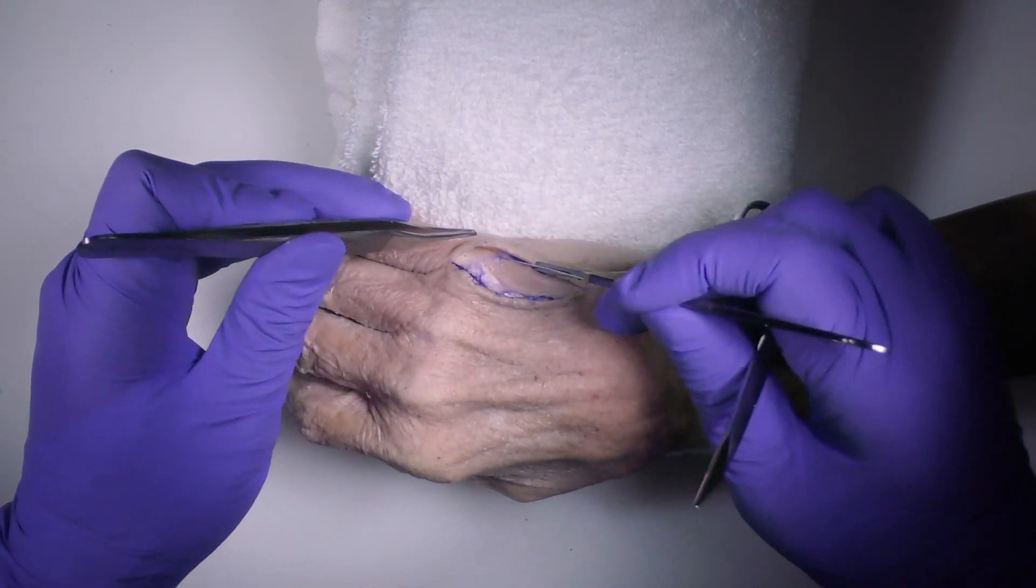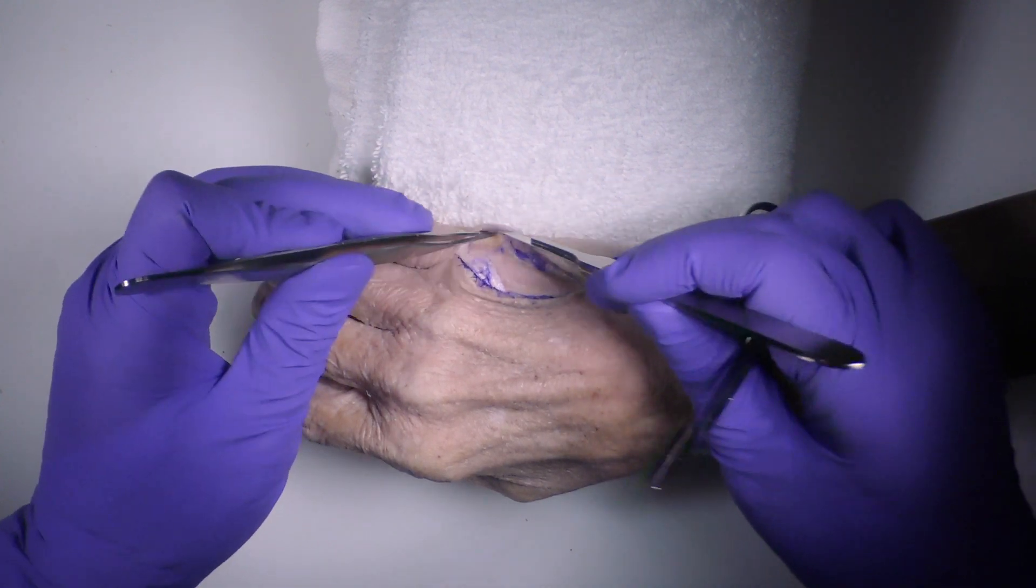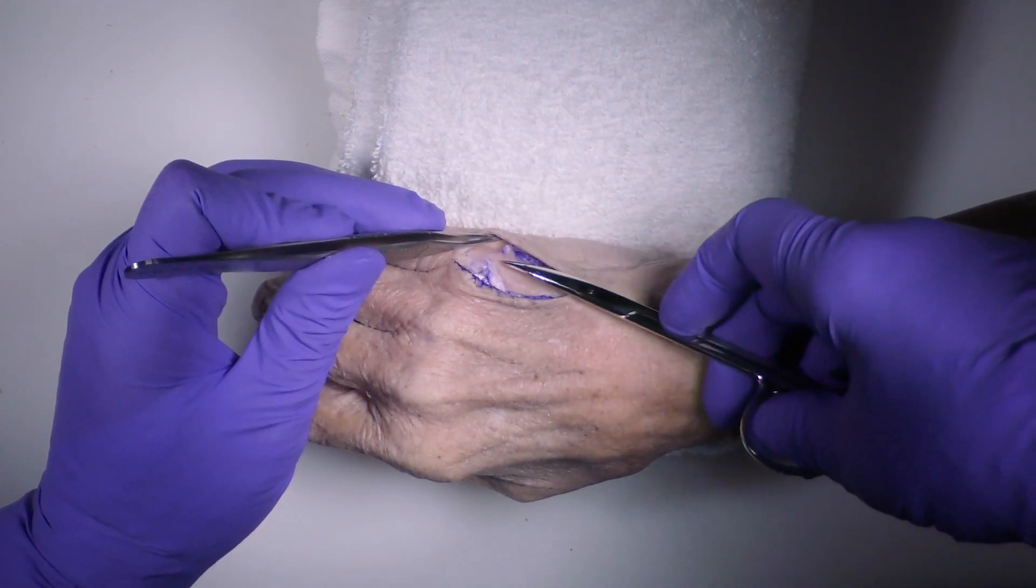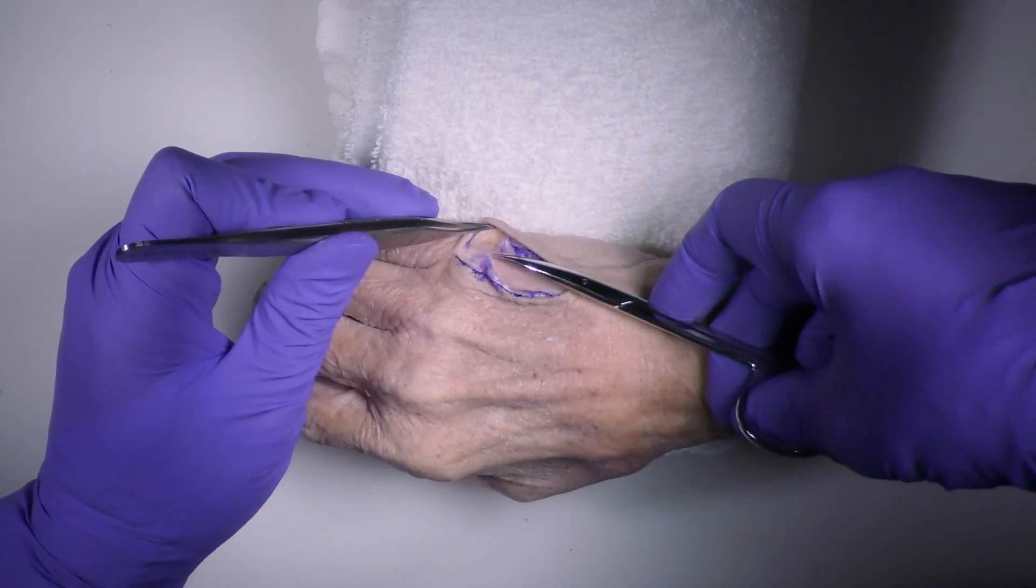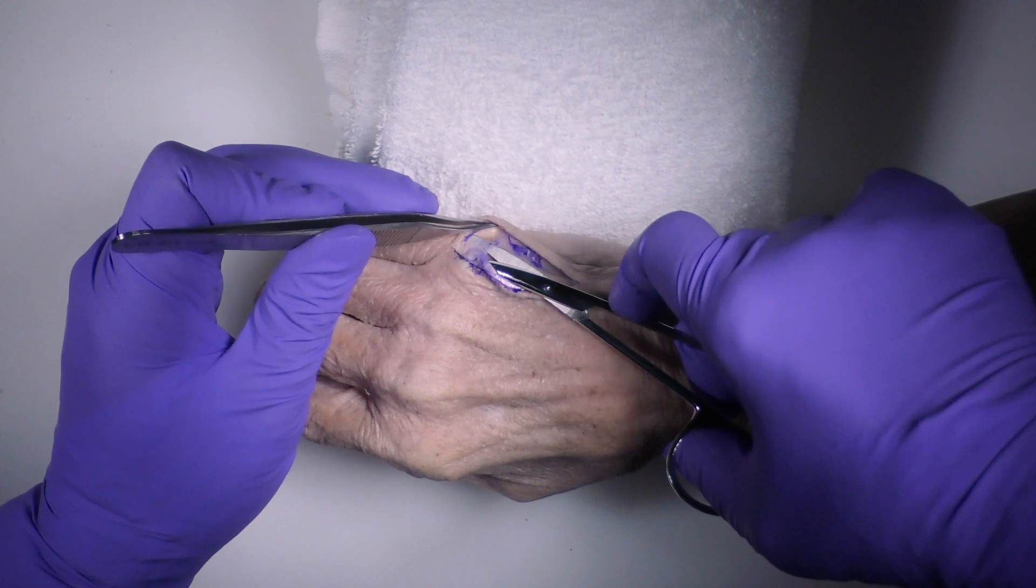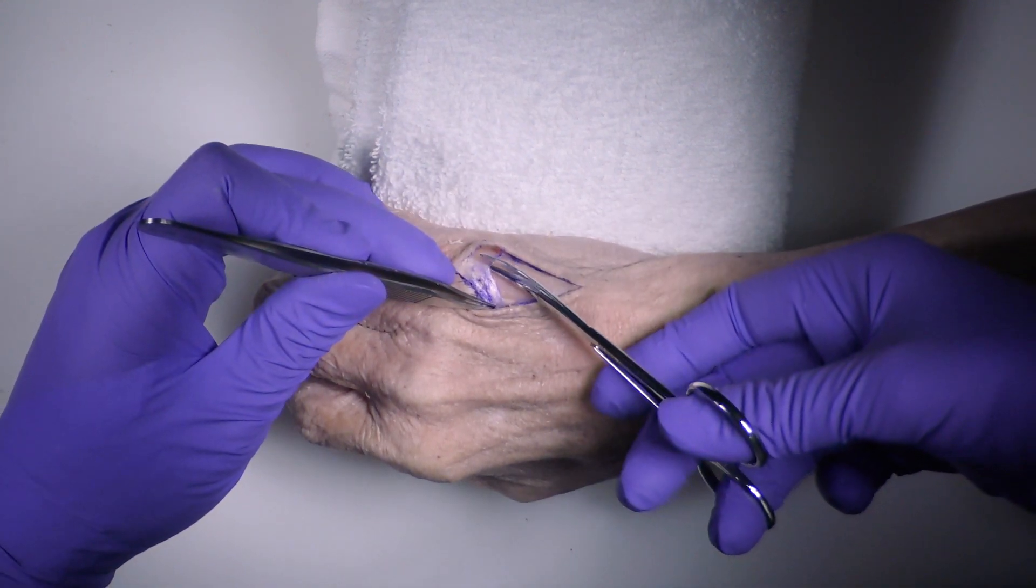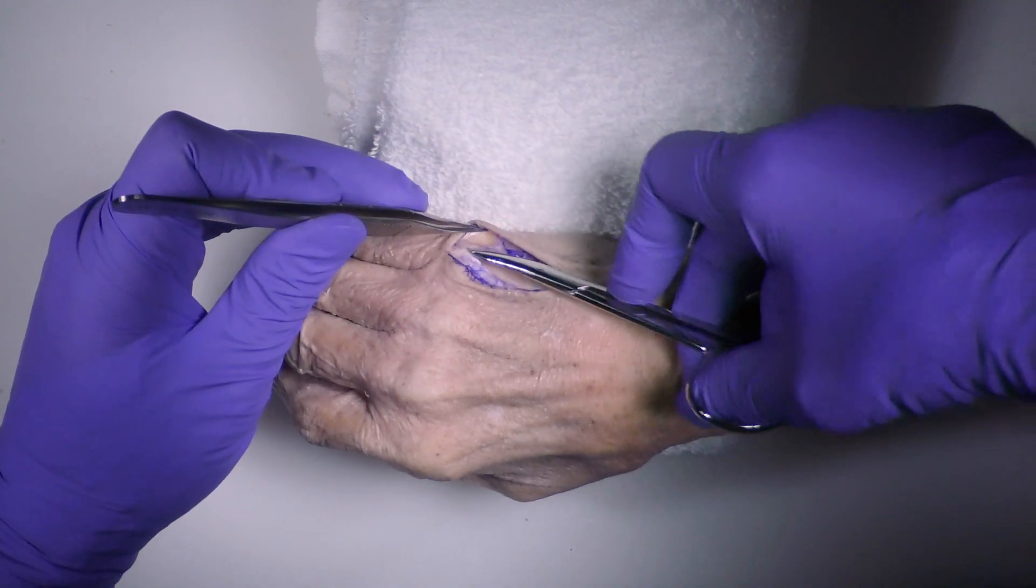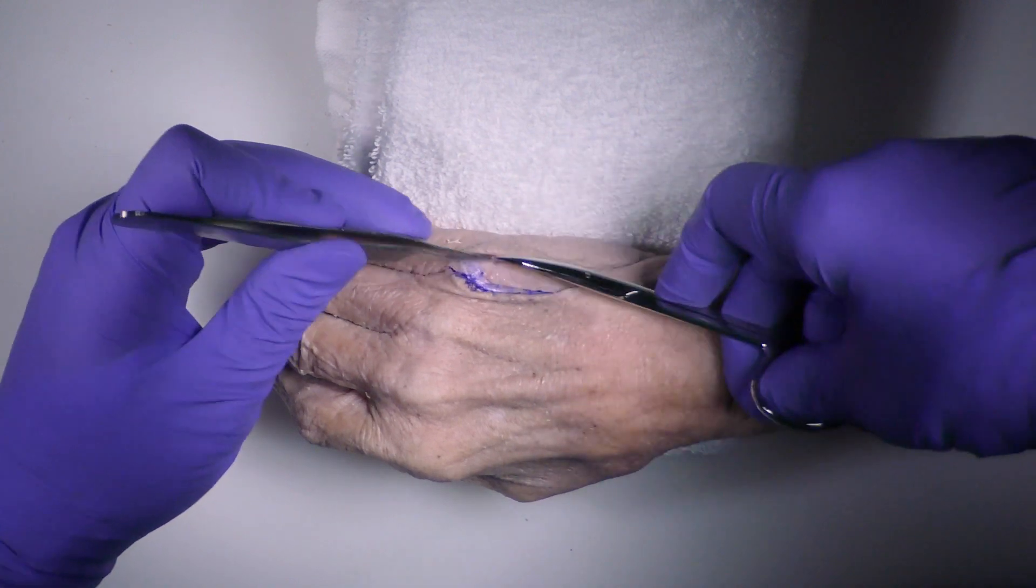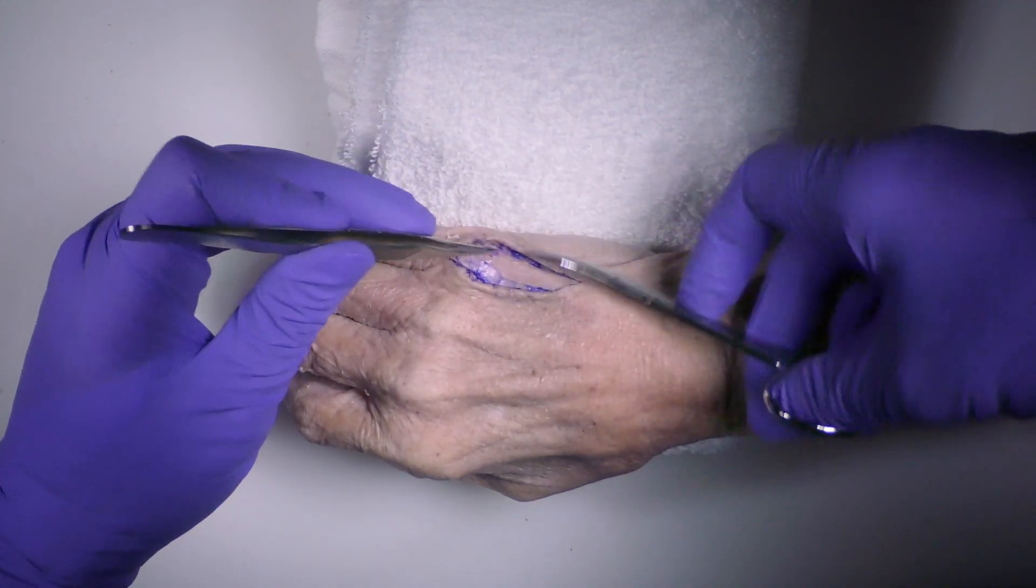So as we expose distally, we start to come into what's called a sagittal band, which is right about here. And you often have to mobilize that a little bit in terms of seeing your metacarpal head and neck regions right here, this layer here. And if you have to take it, you can. We typically will repair this because it can destabilize the tendon a little bit in terms of how it moves and glides over the metacarpal head. So I'm going to take more than I normally would just for the sake of exposure and visualization.